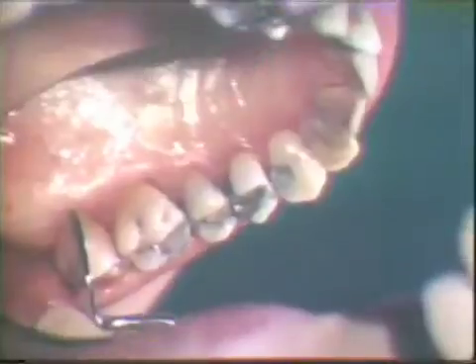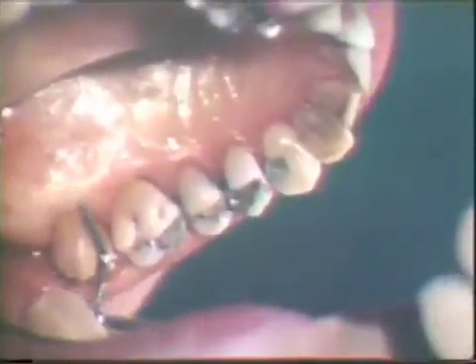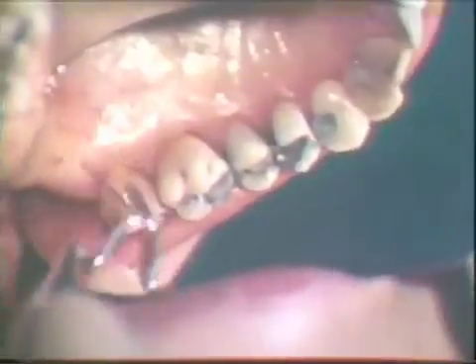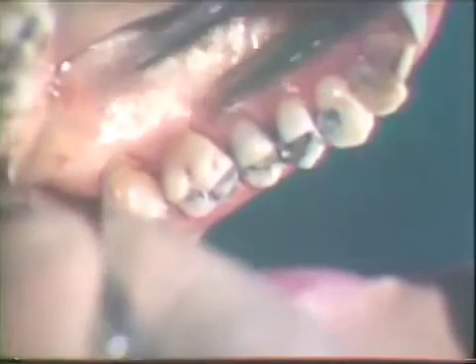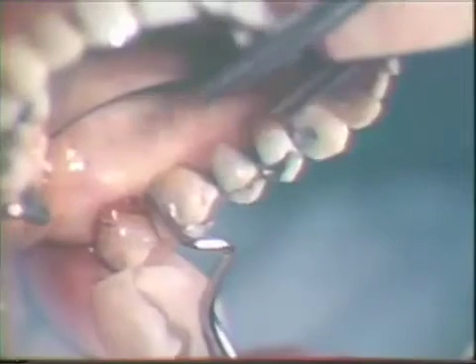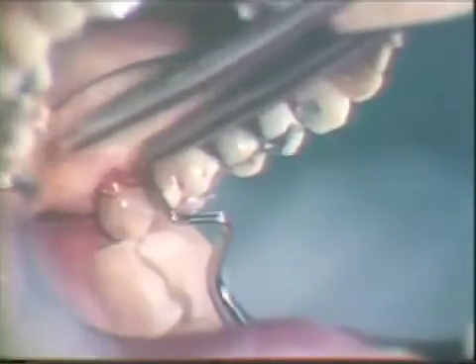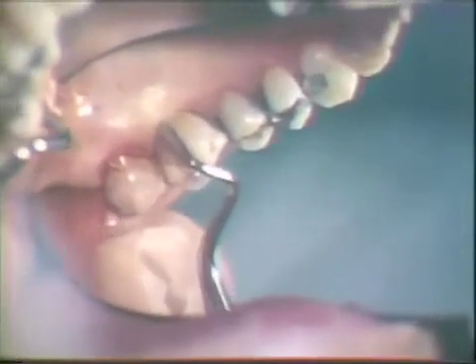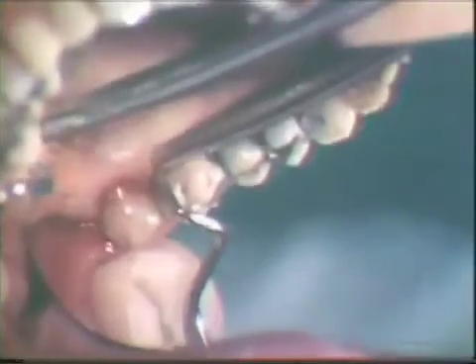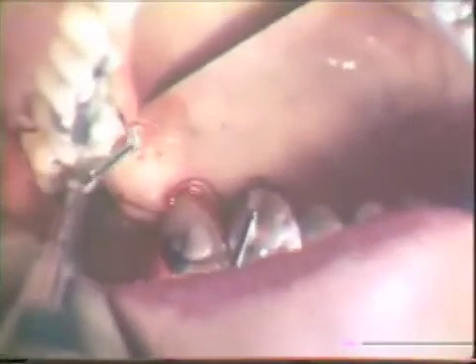An Orban knife is used to make the reverse bevel incision on the palatal side. Slightly exaggerated scalloping will provide good flap adaptation at the completion of the surgery. Notice the preservation of the interdental papilla. An intracrevicular incision is made along the palatal surface of the teeth to separate a collar of gingival tissues from the teeth.